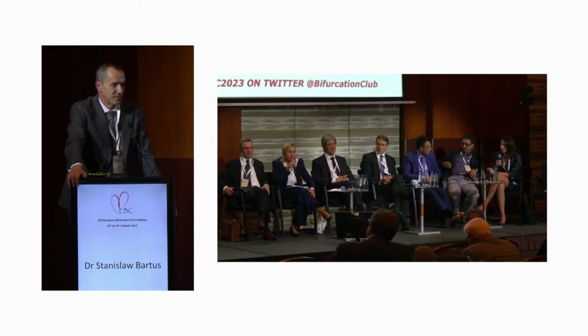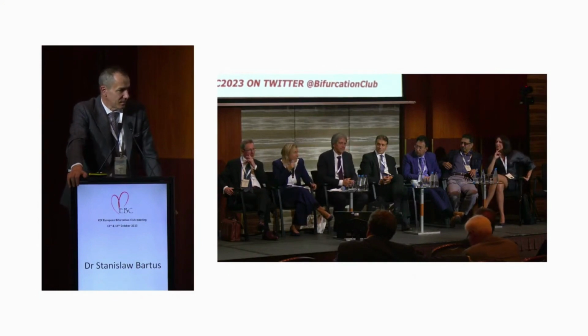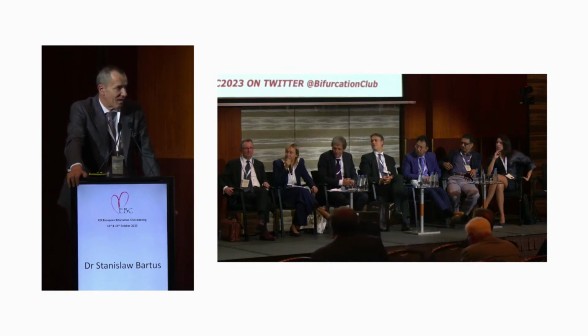Anything has to be adapted entirely to the patient. This is a patient coming with a pulmonary edema, non-ST elevation MI. Do you have a threshold of age, for example, for Impella? Because again, 82, honestly, even if we are the largest user in Italy, one of the largest in Europe, would be a cutoff for us. We don't implant Impella over 75 usually. Do you have a cutoff of age, or is it the clinical indication of the patient?